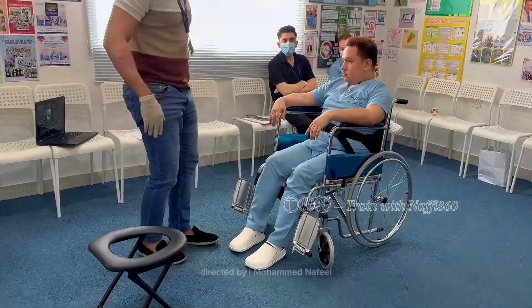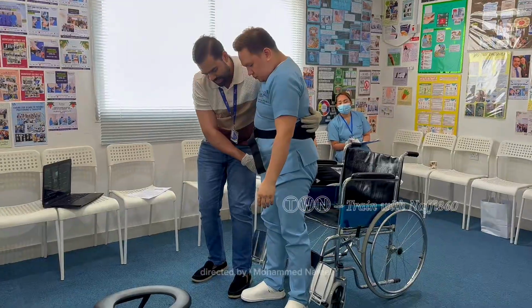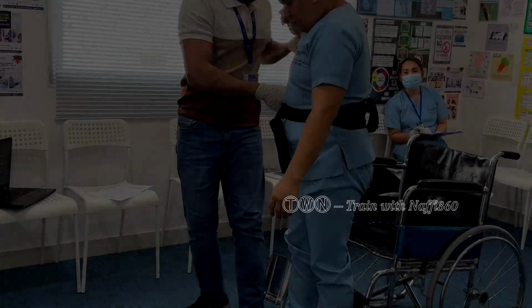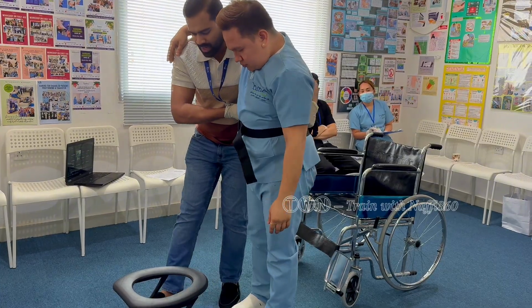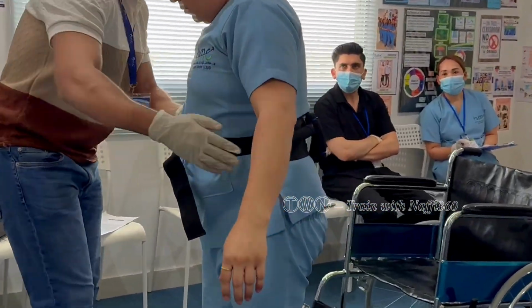Stand in front of the patient with knees slightly bent and back straight. On the count of 3, assist the patient to stand using the gait belt for support. Once they are standing, guide them slowly towards the washroom, keeping yourself close and maintaining support through the gait belt.